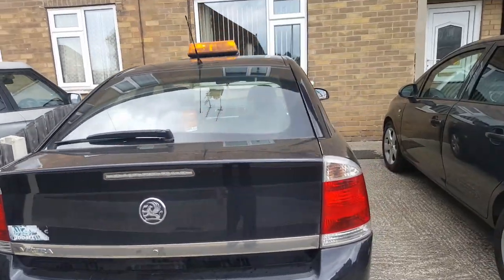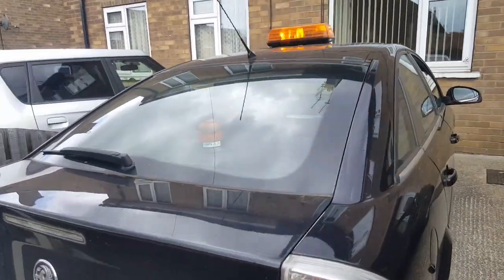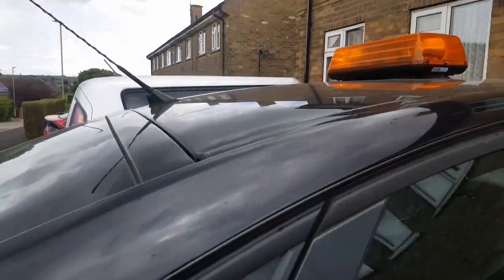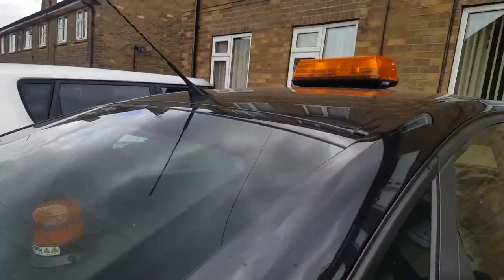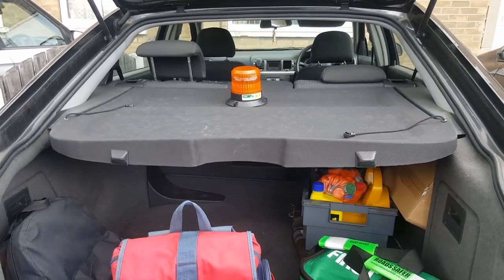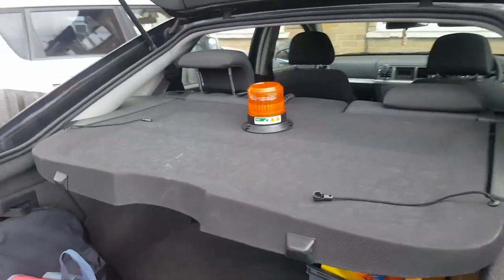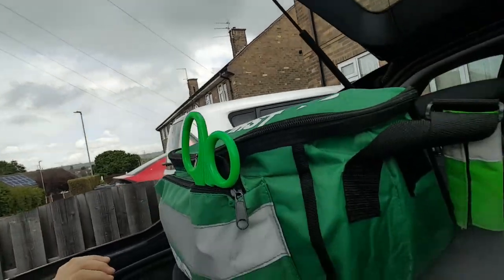Hi guys, it is 999 Medical Team back with another video and today it is Josh. I'm just going to be showing you the first aid kits. I'll be going through the big green one first and then I'll be going through the red one.